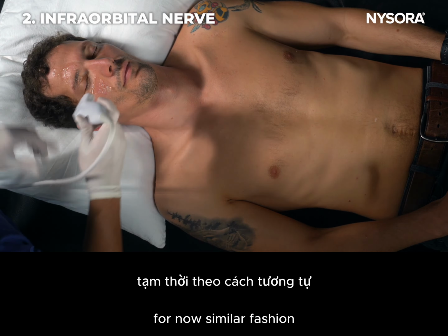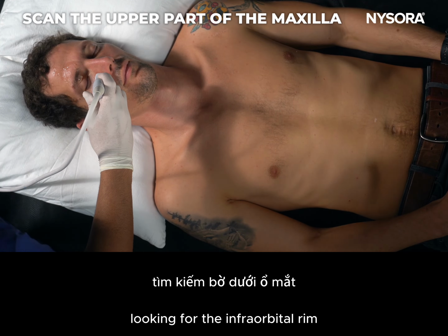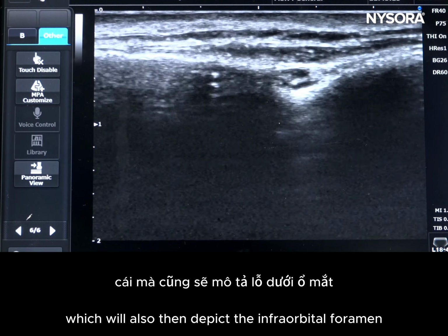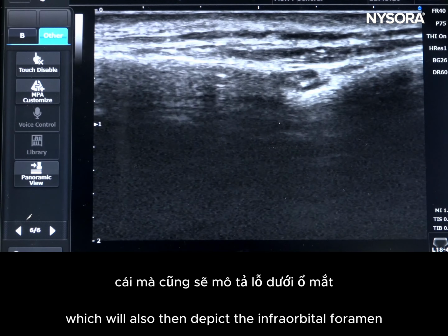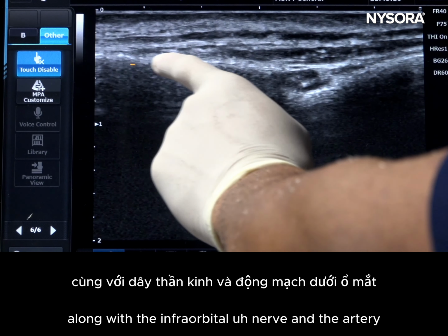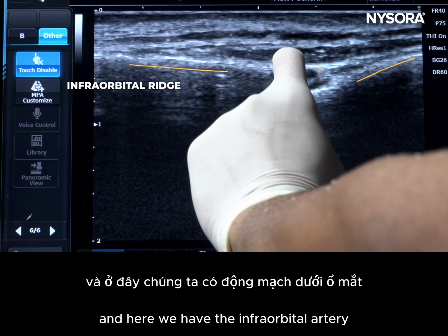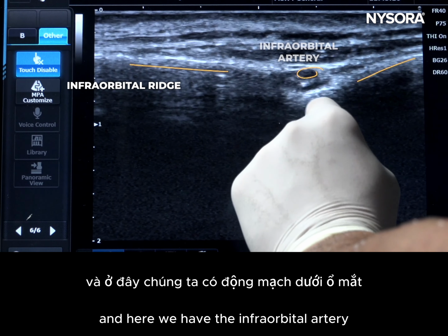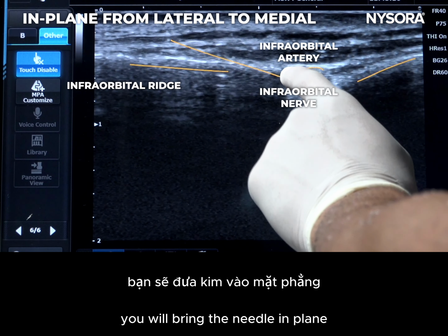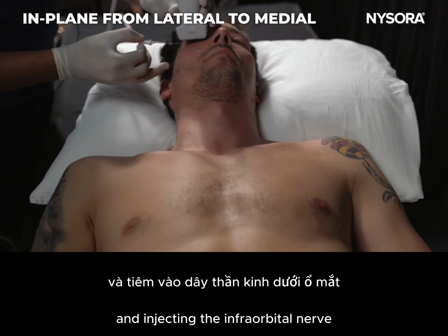nerve. In a similar fashion, you will place the ultrasound probe on the upper part of the maxilla, looking for the infraorbital rim, which will also then depict the infraorbital foramen along with the infraorbital nerve and the artery. So we have an infraorbital ridge, and here we have the infraorbital artery, which has the accompanying nerve. You will bring the needle in plane from lateral to medial and inject the infraorbital nerve.